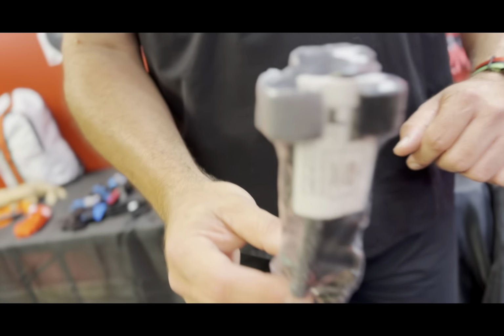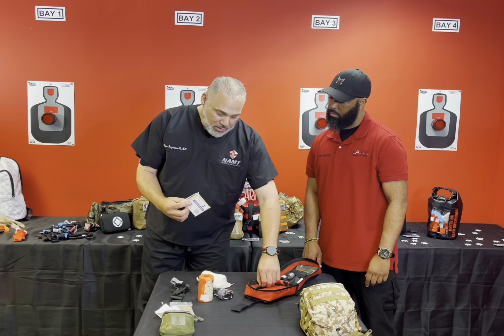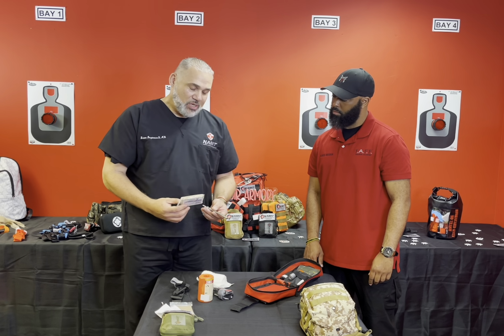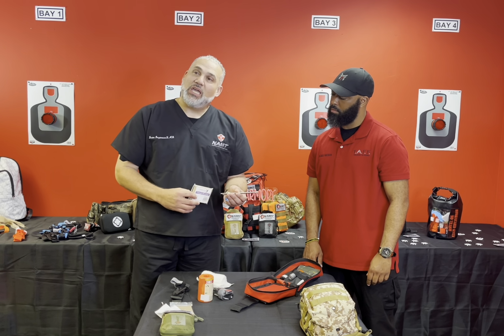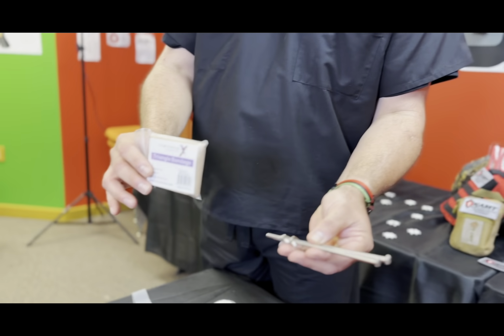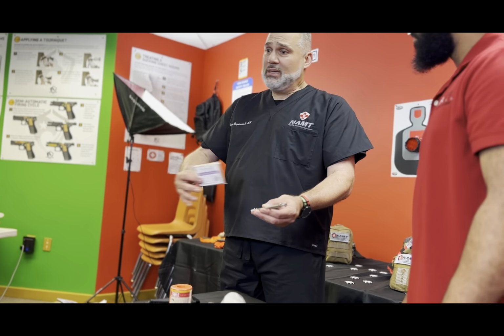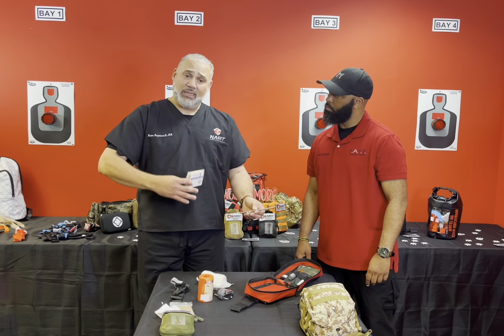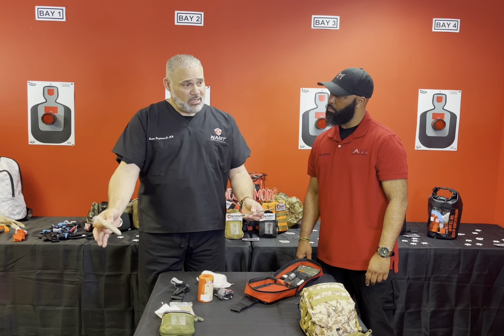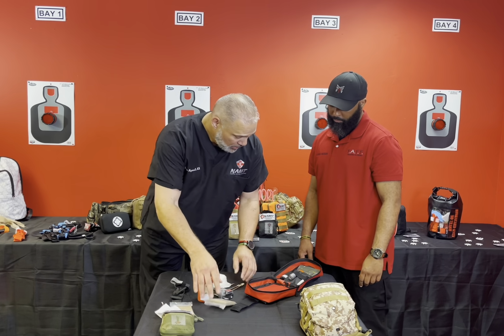Remember, this is a one-time use. You get a 4-inch roll of gauze. You get a triangular bandage. You get 2 6-inch bolts and 2 key rings. And I'm going to tell you guys what this is for later, but this is what's called an improvised tourniquet. And we'll be using that when we use our commercial tourniquet initially. If you come on multiple trauma, you may have to triage and say this person needs a tourniquet, someone else may need one, but you'll have this as a backup, okay?